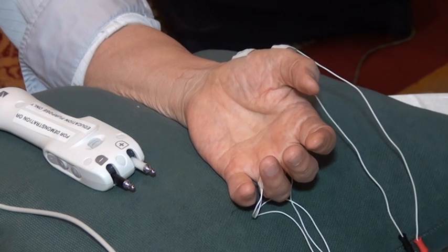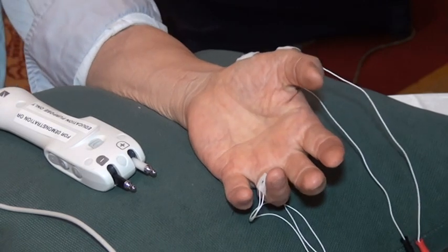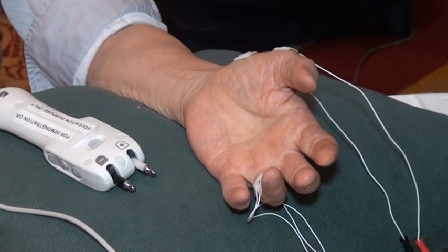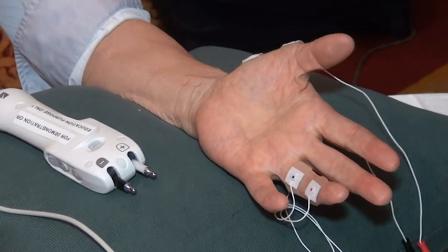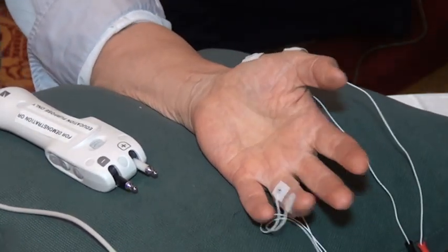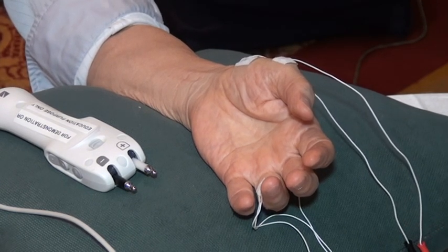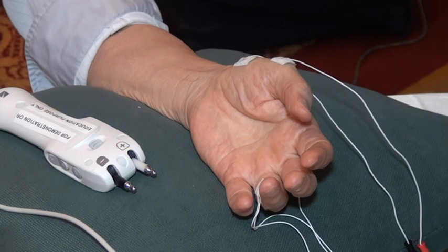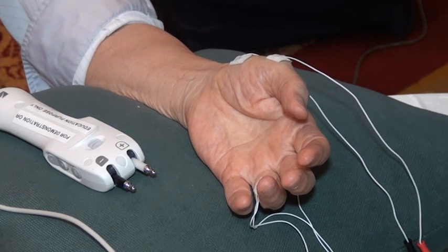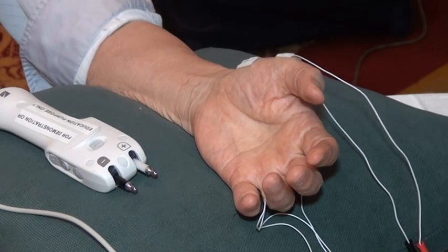What is the answer? When your resident comes with this waveform, and says, I have a decremental response, patient has myasthenia gravis, you say no, and you say why? Just by looking at the waveform, why can you not accept this? Anybody? You accept this then? You think I'm myasthenic?